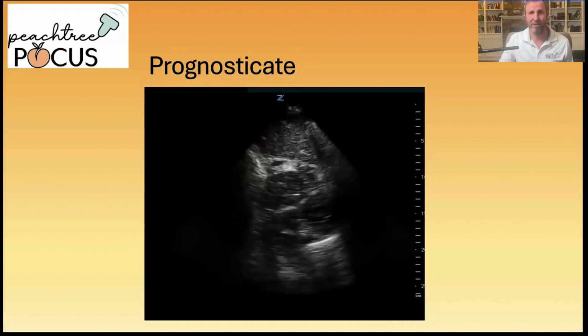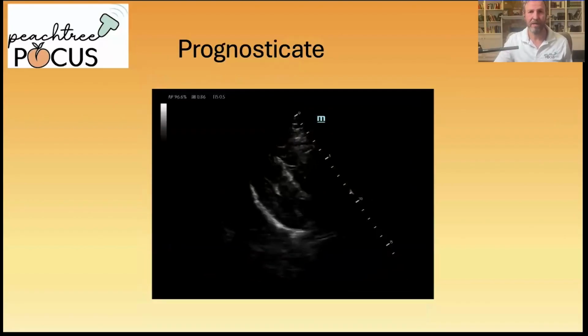And the other way around, you can have patients with a poor prognosis who have a little bit of cardiac activity on their ultrasound. So you really have to take this information of absent or present cardiac activity, understand that this is really important to help prognosticate, but add it on to the full clinical picture in order to help make the decision either to continue resuscitation or to cease resuscitative efforts.